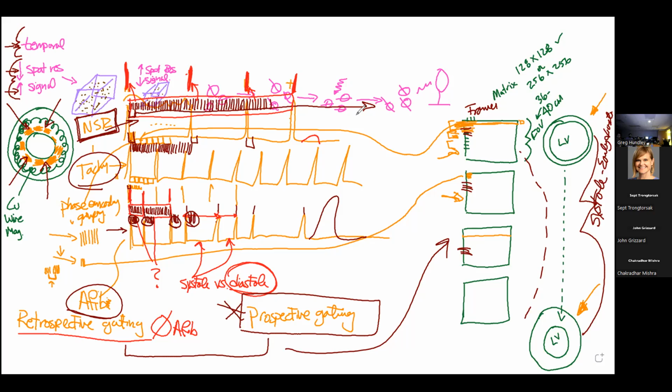If we take the temporal resolution and make that really, really high, down to 2 milliseconds or 3 milliseconds, you're not going to be able to sample your voxel with enough time interval to capture the activity of all those protons.